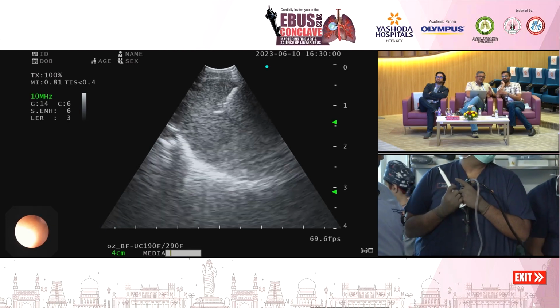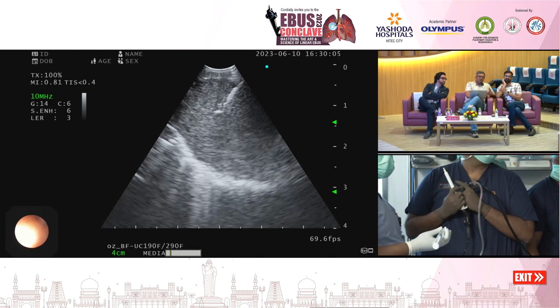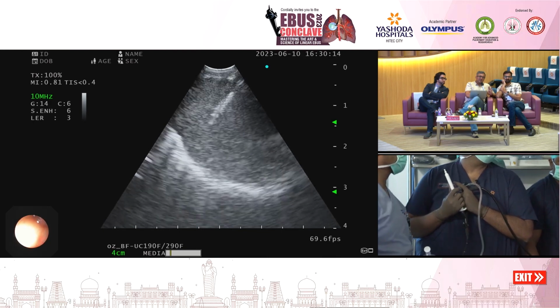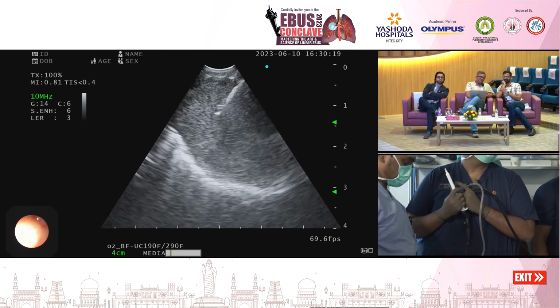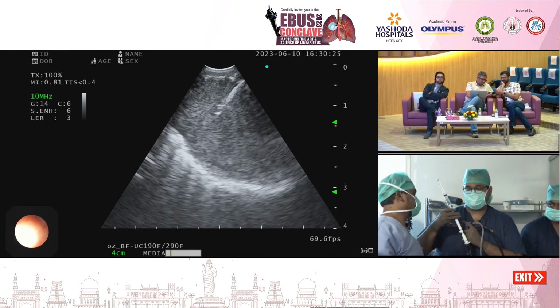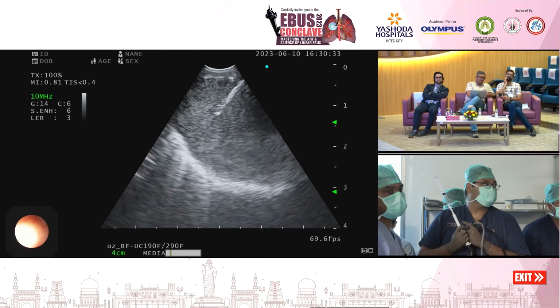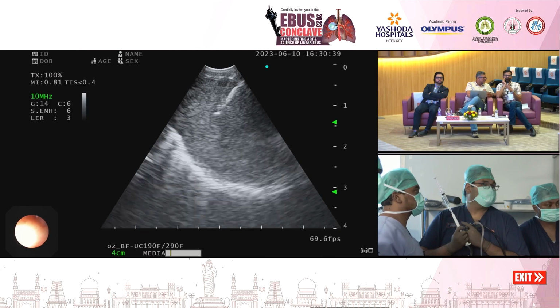The last paper on narrowband imaging, to the best of my knowledge, was probably in 2007 or so. And I have not seen a paper on elastography in pulmonary medicine after the first paper by Takahiro Izumo from the National Cancer Center. On elastography there are a lot of papers, and there are 2 meta-analyses also. So there is data, but no data to say that it can replace a biopsy or aspiration in the near future. The only thing the review articles say is that if you are not getting a diagnosis, you do an elastography, find a more blue part and put a needle in that part.